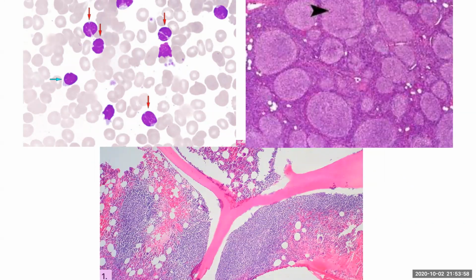All right, moving on to this one. We have peripheral involvement by these very deeply clefted lymphocytes. We have this on tissue, and we have these classic findings in the bone marrow trephine biopsy. So given all these three, what's this lymphoma? Follicular lymphoma. Follicular, right. So clefted, I think these are classically described as buttock cells in the peripheral circulation. Tons of follicles all packed together. And classically in the bone marrow, you see paratrabecular nodules.